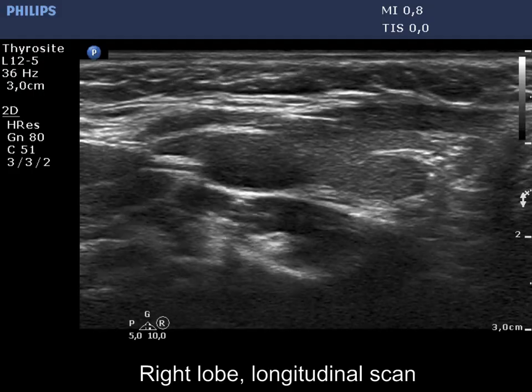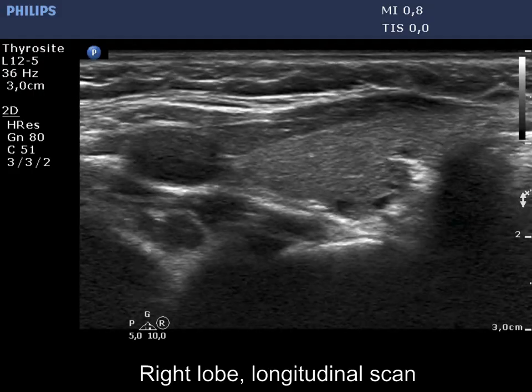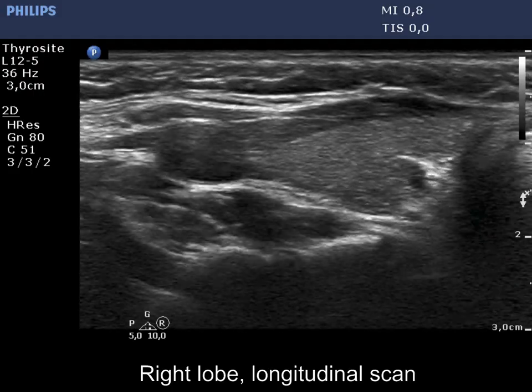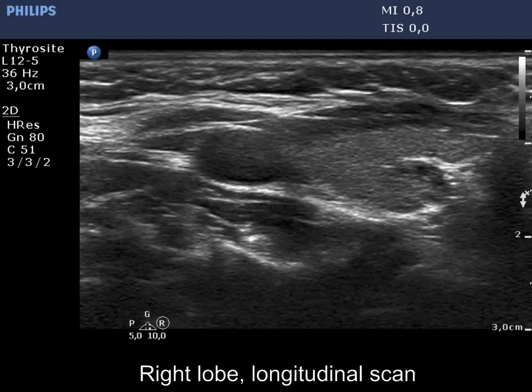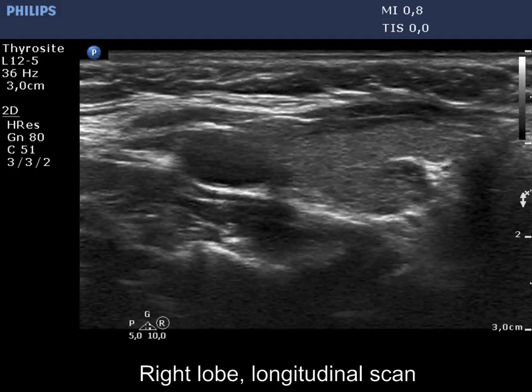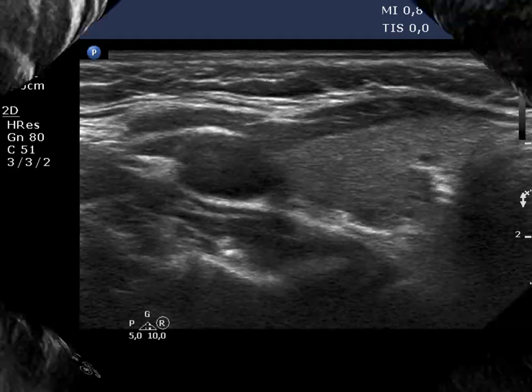In certain sections, this hypoechoic area mimics a nodule. However, other sections reveal that the thyroid tissue is continuous in this and other parts of the lobe.